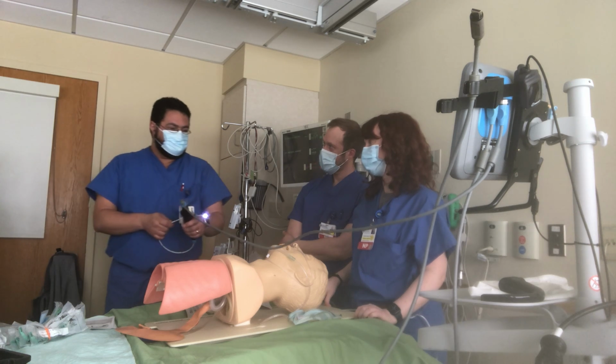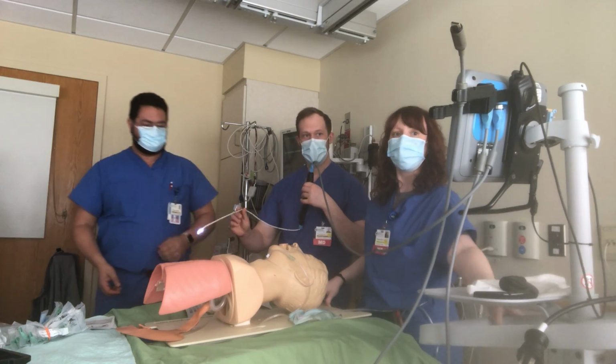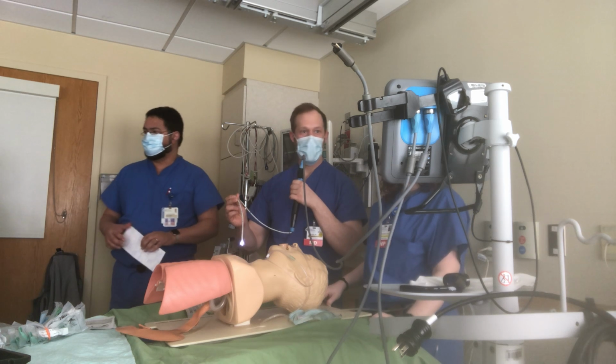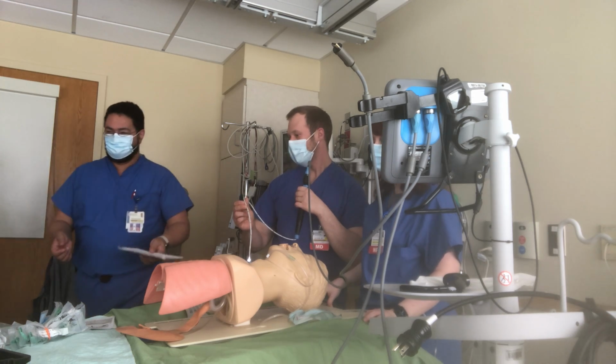All right, so we're done with all of these things. So let's go. Let's see if you can do that, and then we'll have Professor Gonzalez do it and Professor Trish do it. What are we going to do? What are we missing here? There's two things missing. He's too eager to do the scope. I gave it to him. You need an ET too. All right. So we need the ET tube.